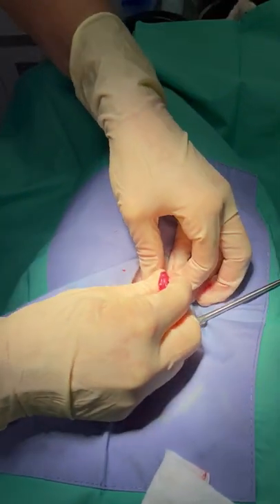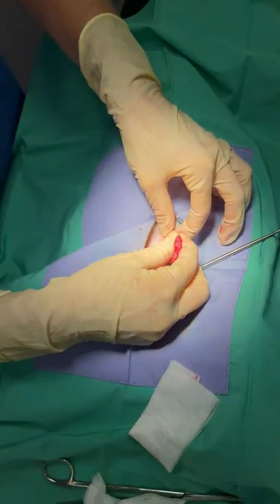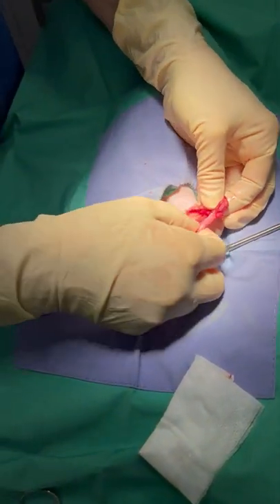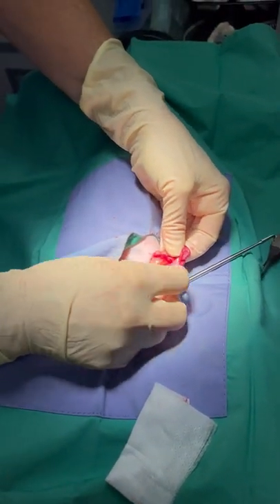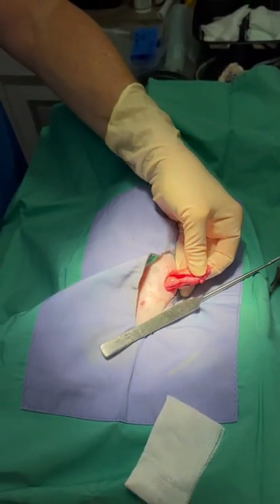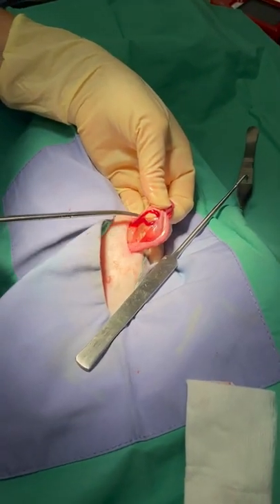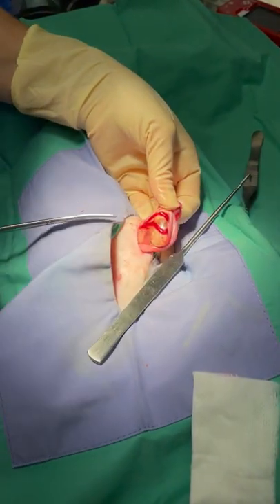Now we've made our incision a little better. What I'm doing is pressing down on this tissue rather than pulling up, because I don't want to tear anything prematurely. I've given myself a little bit more room, and I feel better that things are not really tight in here. Thanks to the suspensory ligament holding everything still, I've separated out the horn, the blood vessels that I need to tie off, and the suspensory ligament using my fingers.